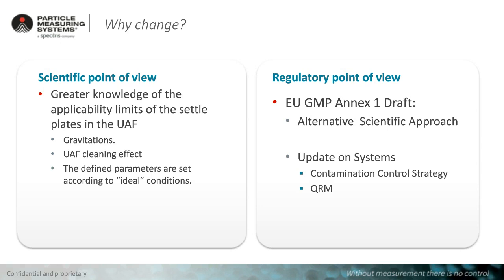And then the regulatory point of view is the EU GMP Annex draft from 2017, which we hope will finally be released in 2020. It gave a clear indication that we should now use scientific approaches and scientific understanding based on risk-based approaches under a quality risk management approach to really review the data and the methodologies you're using for each sampling point.